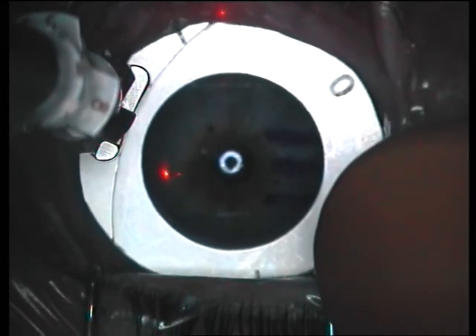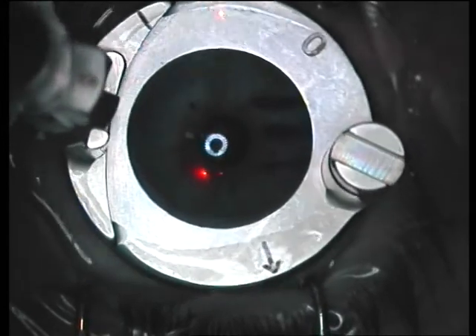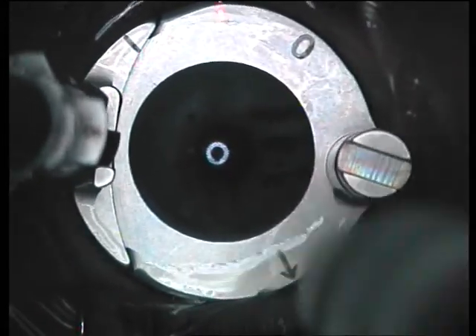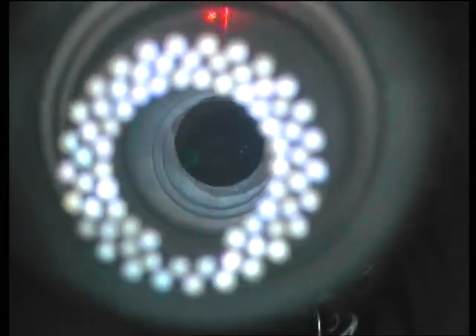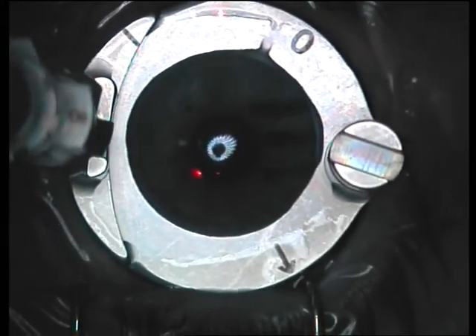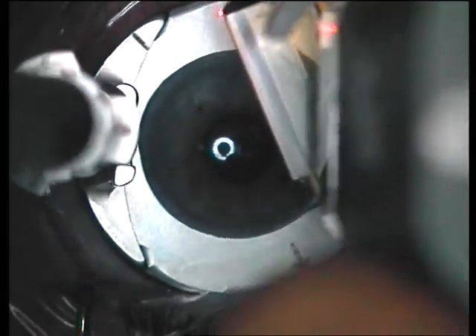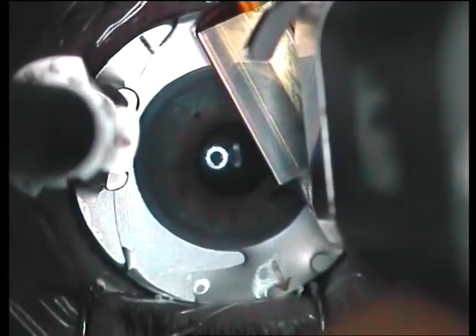Here you can see the cornea has been marked, the extra ink has been washed away, the suction ring is placed on the eye and the suction has been started. The cornea is applanated to differentiate between true and pseudo-suction. Now the cornea has been wet so that the microkeratome head can easily pass across the cornea.